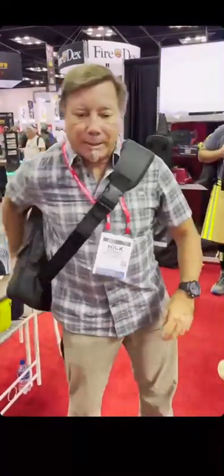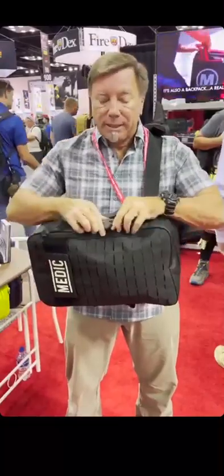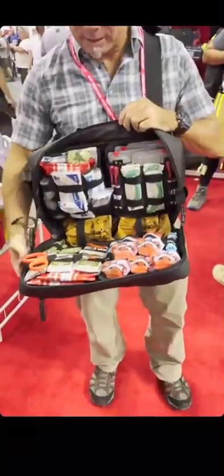Nick from Rescue Essentials here to demonstrate the new MERET TRS Pro X sling bag. This is a bag that's specifically built out for tactical medicine.